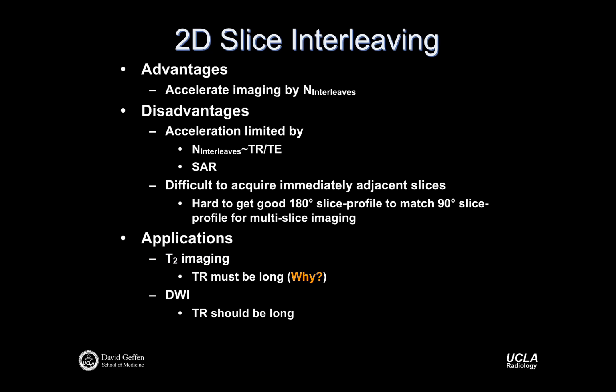Similarly, I think Ben Alling said in the last lecture we'll cover this, which is diffusion-weighted imaging. I find it totally amazing, but MR can be sensitive to the self-diffusion of water, how easily or not water molecules move around in soft tissues. It's another example of typically needing a long TR for signal recovery. And so again, multi-slice 2D imaging, absolutely. Multi-slice diffusion-weighted imaging, absolutely.